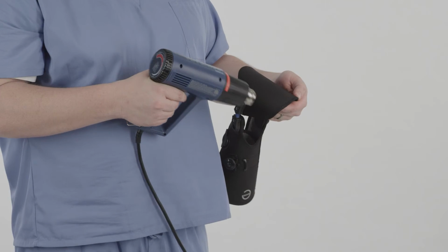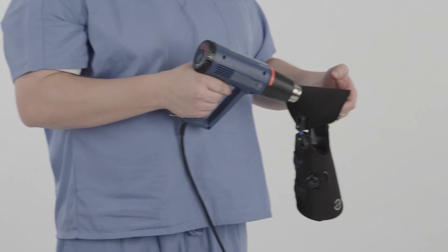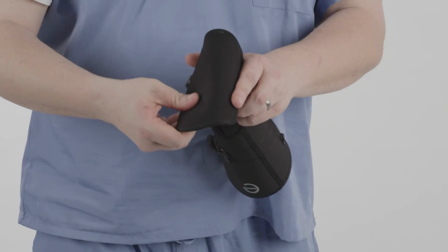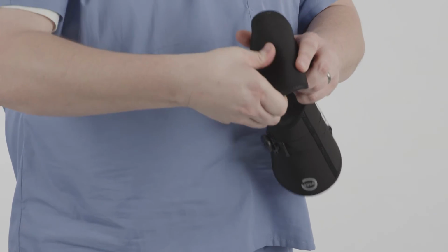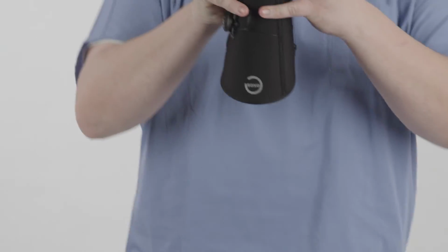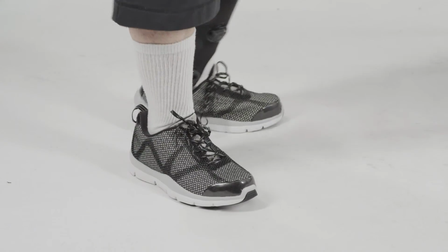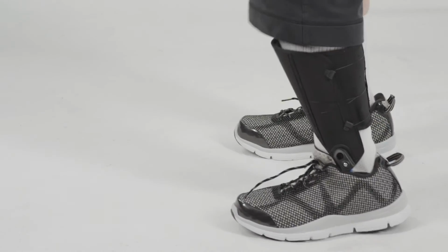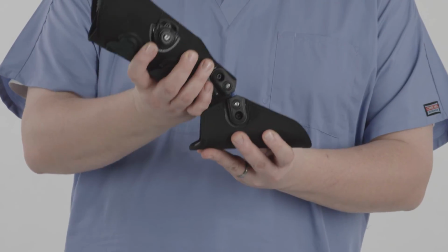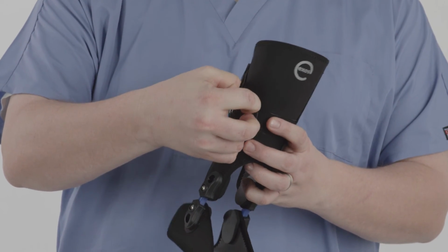Using a heat gun, spot heat the area where you'd like to make the adjustment. Only heat the specific area, not the entire brace. Once the material is malleable enough, reform the Exos material using your hands to provide the relief needed. Place the brace back into the shoe and ask the patient to reapply and verify the adjustment has relieved any pressure points.